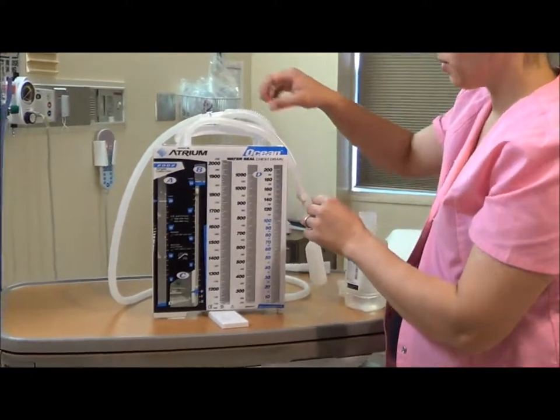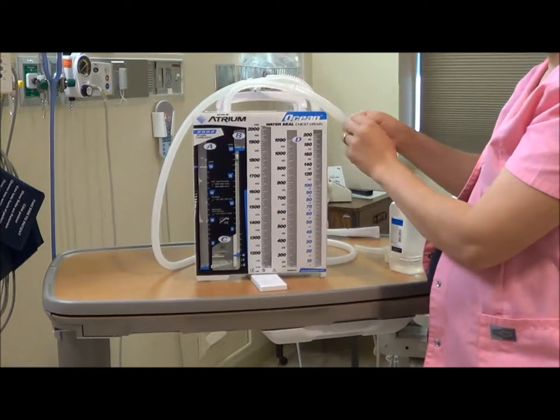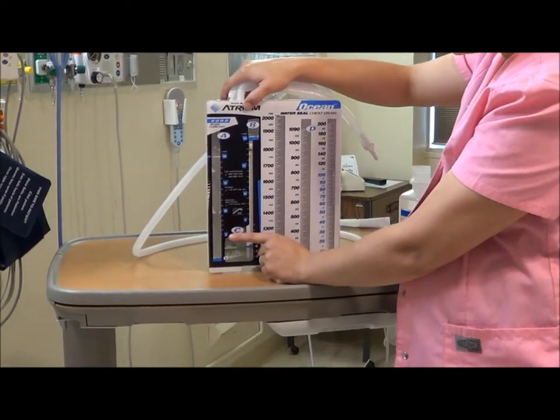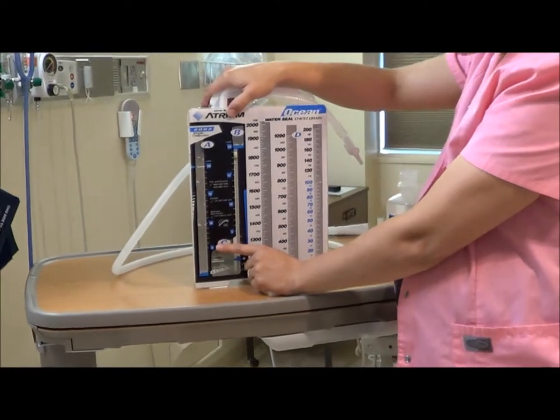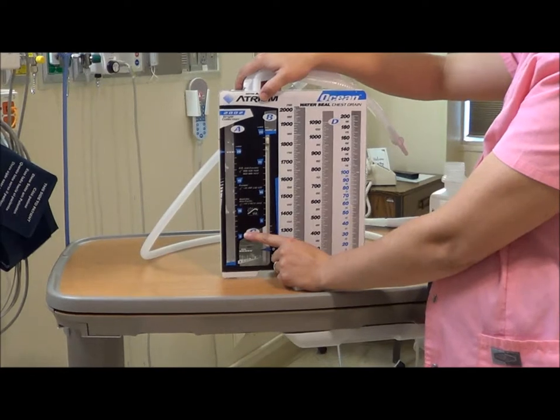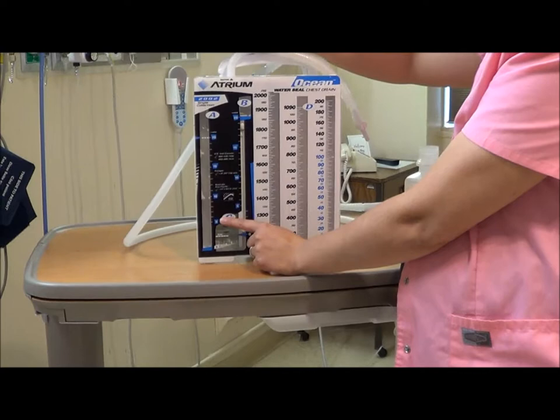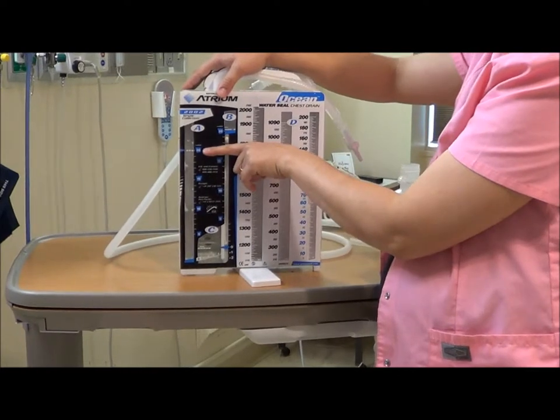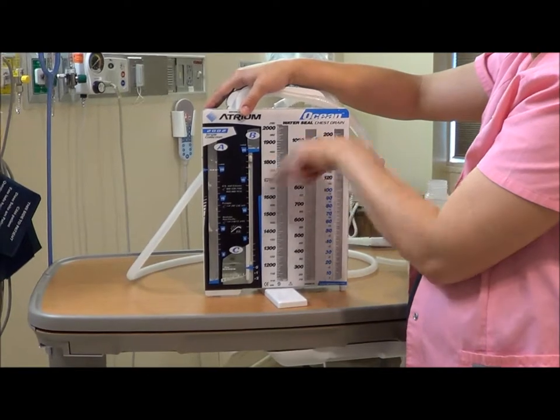You can remove the funnel when you're done with that. Next we will fill up chamber A. This is the chamber where the amount of fluid you pour into it actually sets your suction amount. Once we hook this up to suction, it doesn't determine how much pressure is applied to the lung — it is how much water. The usual clinical rate is to fill it to that 20 centimeters of water.